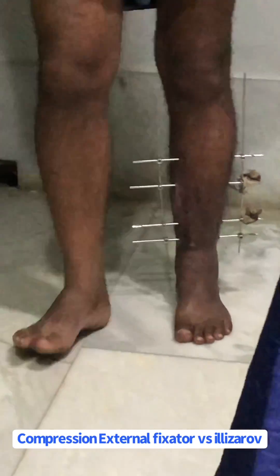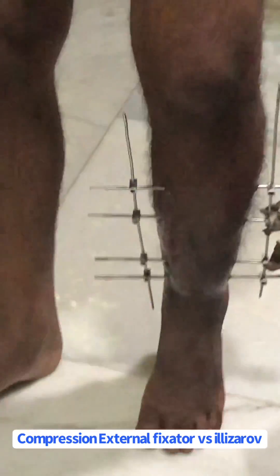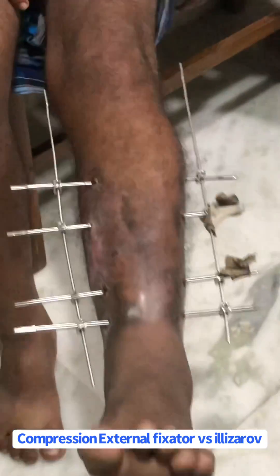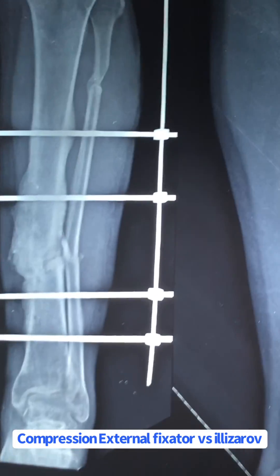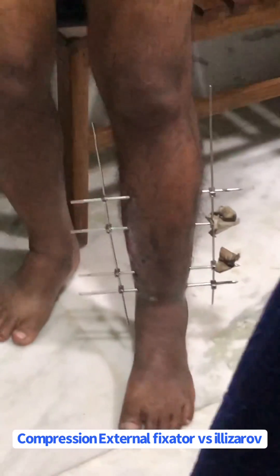In cases where a tibia fracture where a plate is being applied gets infected, after removal of the plate only two options are left: one is applying an Ilizarov, and the second option is applying a compression external fixator. In this case, I am showing you that a compression external fixator is being used for three to five months.